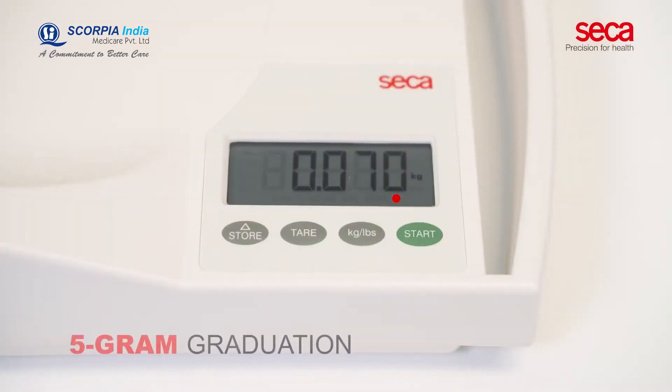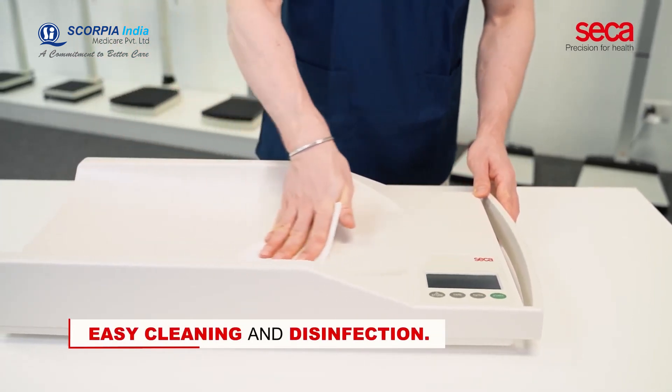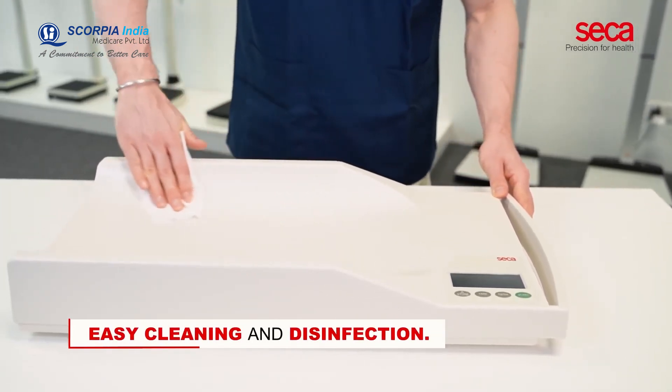The 5-gram graduation ensures that even the slightest changes in body weight can be monitored accurately. The seamless surface with smooth and round edges ensures easy cleaning and disinfection.